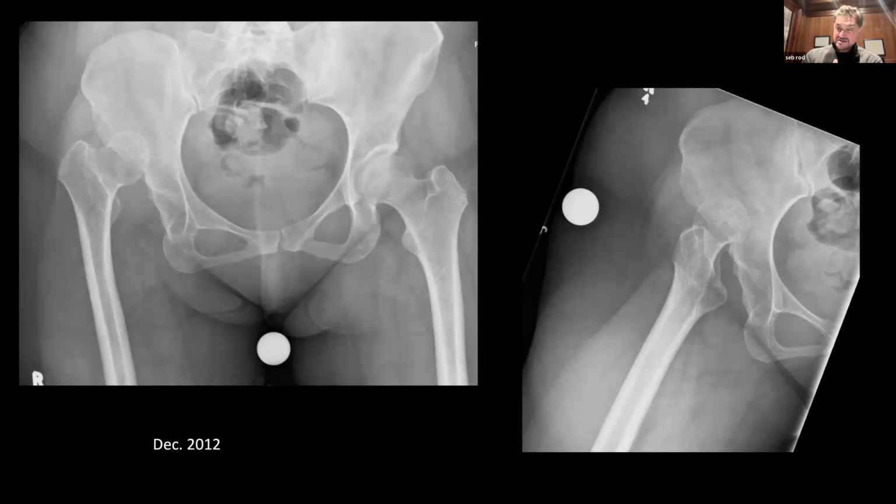When you ream these cups, it's soft, crappy, if you can even call it bone. So every touch of the ream, you have to be careful. Having an X-ray there to show you exactly where that cup is is quite nice. I have a low threshold to use dual mobility in some of these cases, if you've had to release quite a bit and you're worried about stability, and it does give you a bit of leeway.